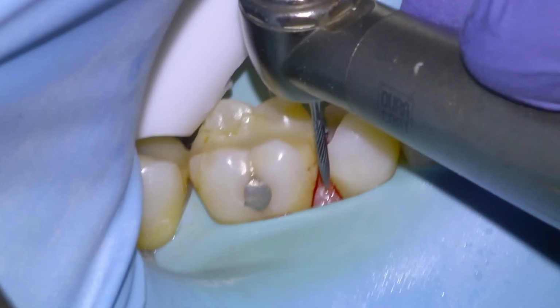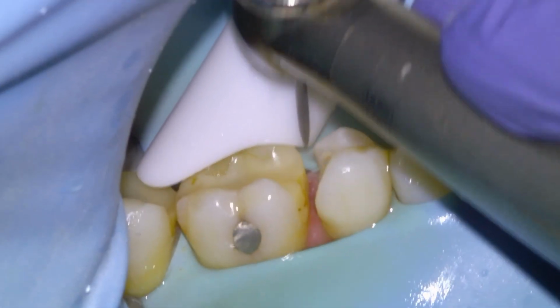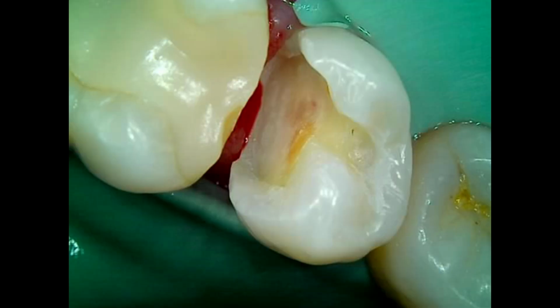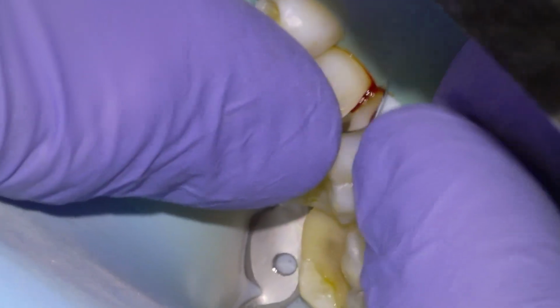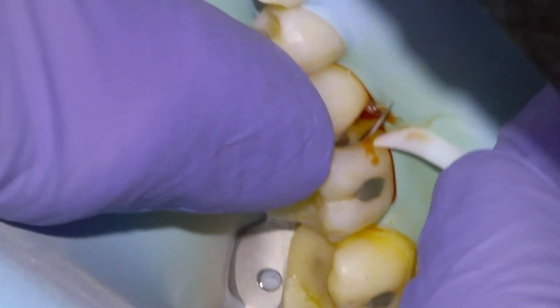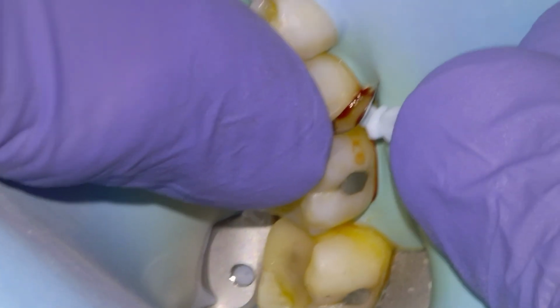We'll round off any kind of sharp or thin enamel edges with the carbide flame. And there we are. That's ready to restore. So we'll grab a sectional matrix and place it down, put a wedge in. I usually like to apply some apical pressure to the matrix and then wiggle the wedge in and out to get it as far down the sulcus as possible. And then we'll put it in fully.